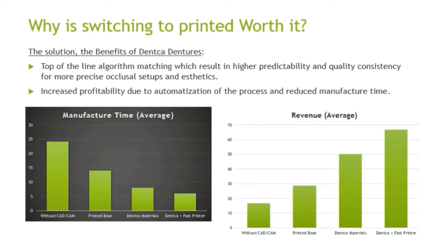Number one, because you are using 3D printers to do the job of that technician, and you can free the technician's time to design dentures or post-process the dentures while the dentures are being printed. That technician is free to do other things in your laboratory as well. And of course, making these printing processes faster and faster as you move forward means time is money, and of course it opens up time for you to receive and process more cases as well.